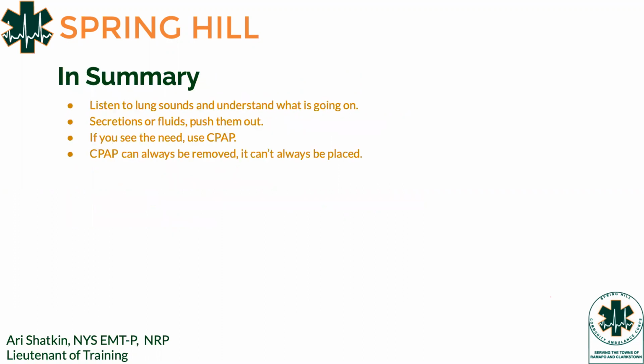So in summary, listen to lung sounds and understand what's going on. Really build an understanding for it and imagine while you're listening, what am I listening to and what's in the way? Secretions, if you hear them, or fluids, you can easily push them out with this type of device. You can have them cough a few times beforehand. That's also fine. See if they can clear it themselves. But when in doubt, use CPAP.